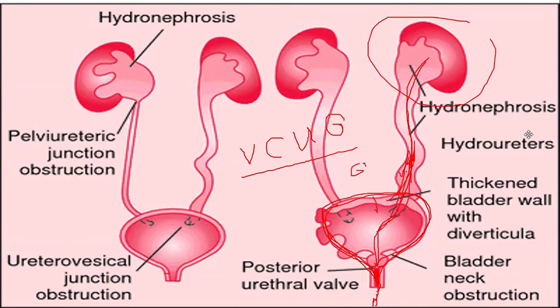But if, for example, once the baby was urinating, aside from the reflux, it went up into the pelvocalyceal system, but with no dilatation of the calyces yet, that is stage 2.